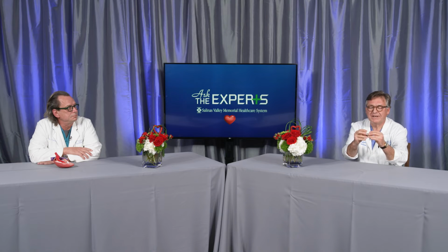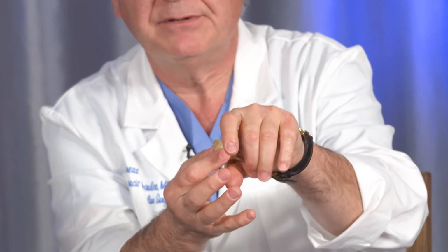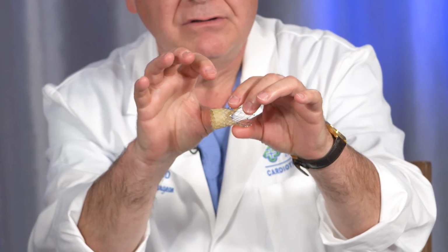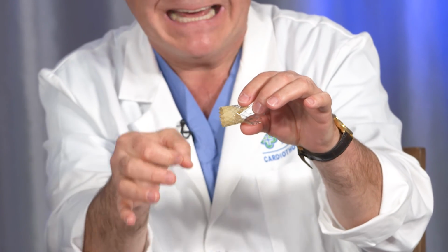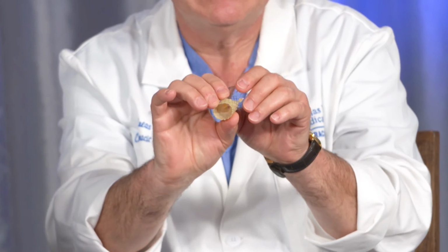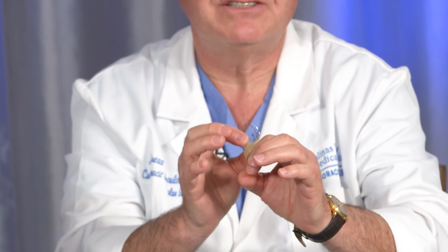But the point here is that we can actually constrict the valve within a sheath, within a small tube about the size of a magic marker, maybe a little bit smaller. And it's all constricted. We go up the groin, and when it's in the right position, we allow it to flower. We allow it to open up, and it pops out to its normal size. And it's a little bit bigger than the diameter of the native aortic valve. That makes sense? So in other words, we put it in and it fits in snugly, and because the valve is a little bit bigger than the area it's going into, it stays in place.